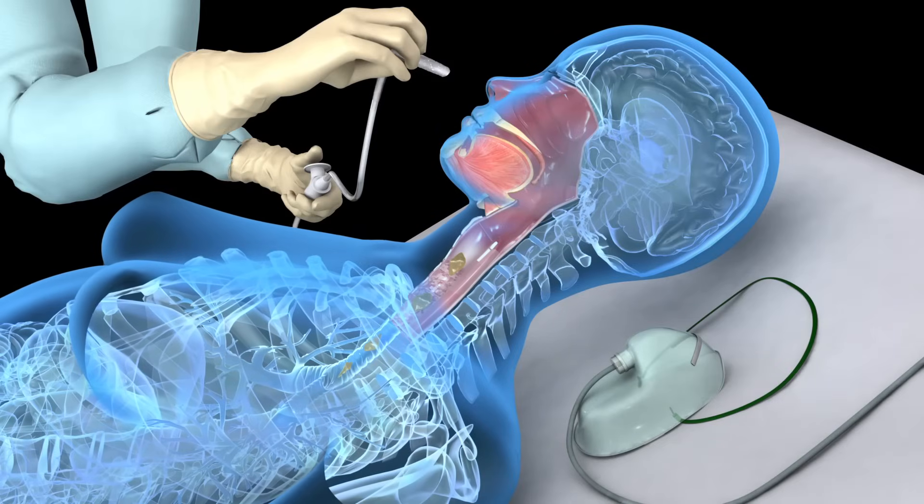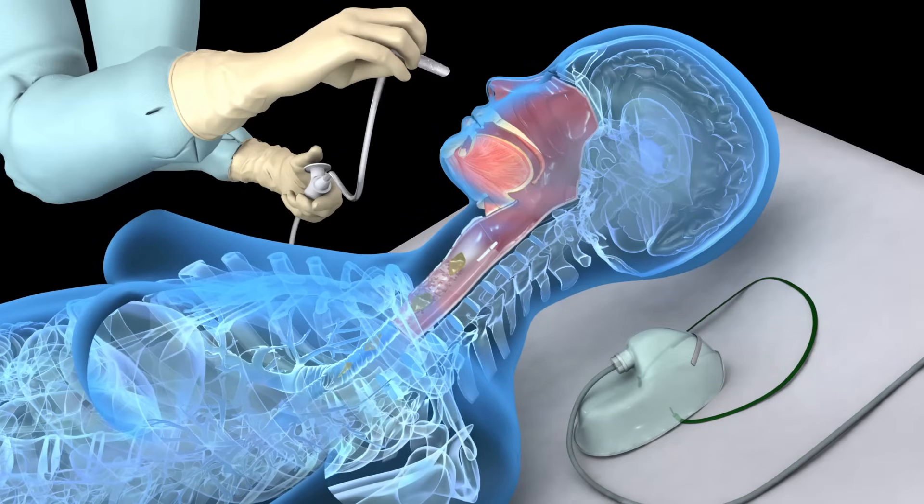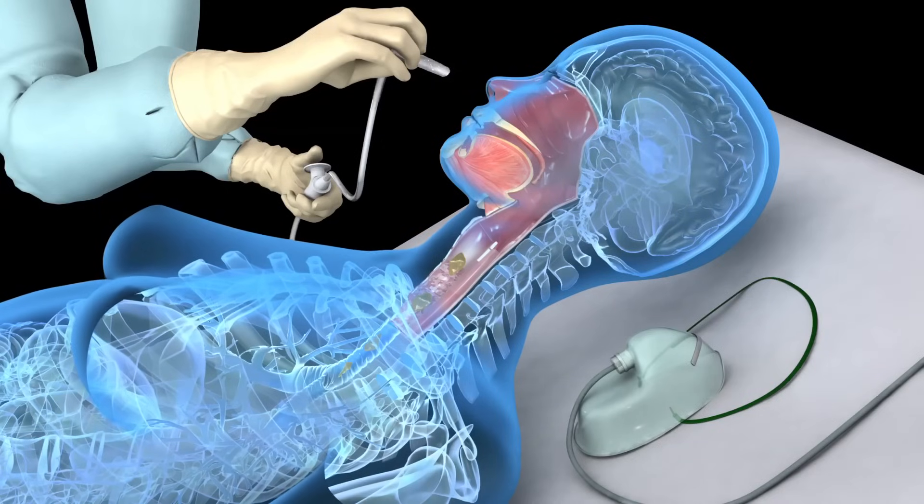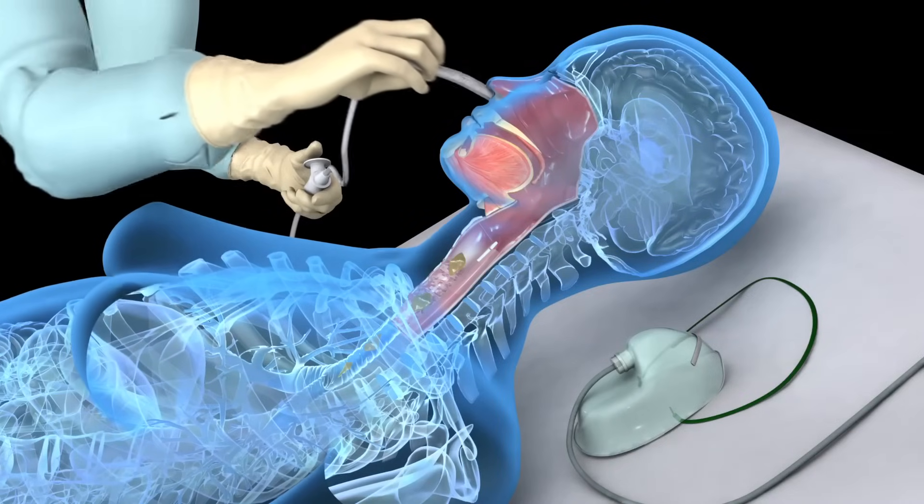As the patient inhales deeply, gently but quickly insert a well-lubricated suction catheter into one naris. Without applying suction, advance the catheter into the trachea.